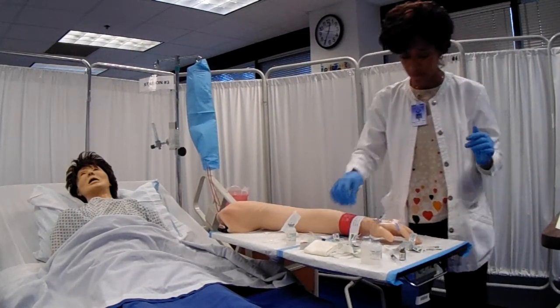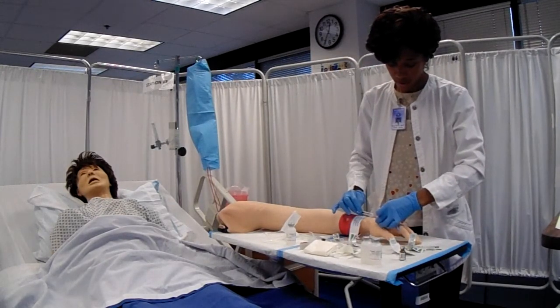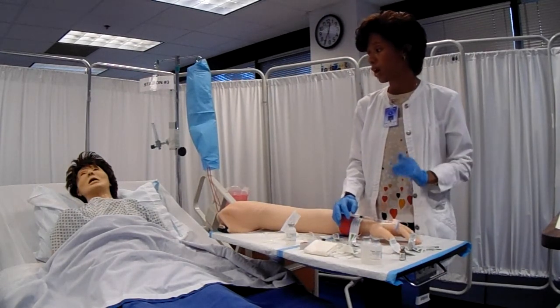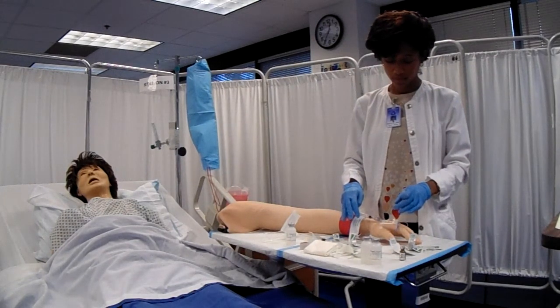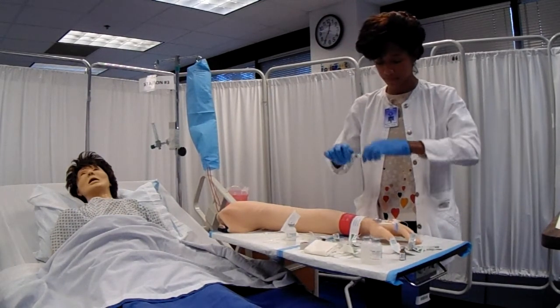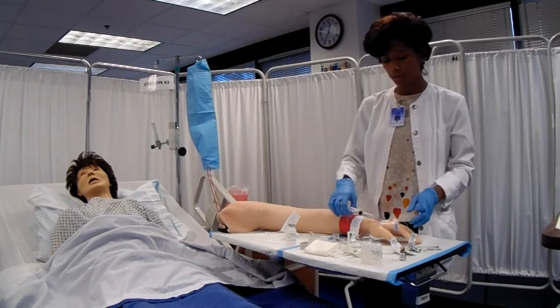Now that I've verified patency once more, I'm going to go ahead and administer the medication. Let me know if you feel any discomfort. So I'm administering this over approximately 2 minutes because it's 2 milliliters, 20 milligrams. Okay, how do you feel? All right? So that was 2 minutes. And now I'm going to flush at the same rate I administered the medication. I'm going to flush with 3 ml, so that's another 3 minutes.